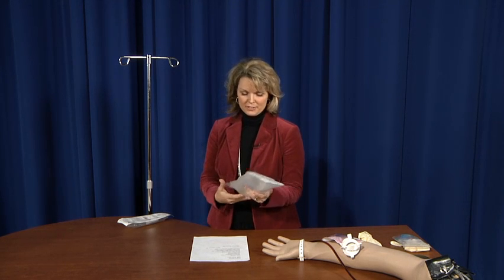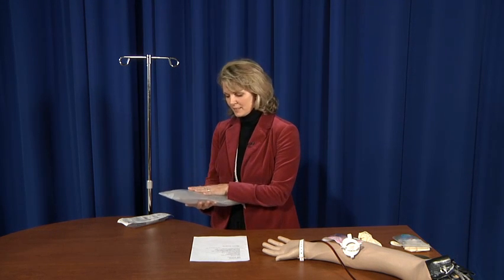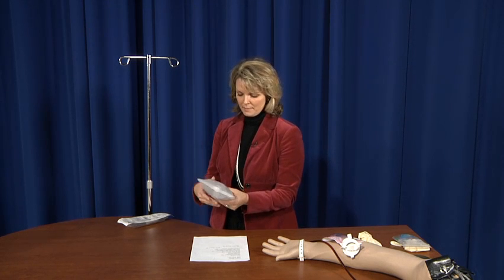This is a medication, so we want to make sure that we have our 6 rights: the right medication, right dose, right route, right time, those type things, right patient. So we look at the bag first, analyze the bag. We want to make sure that our medication is safe. So we're looking at it for clarity, making sure that it's not cloudy, there's no precipitate.